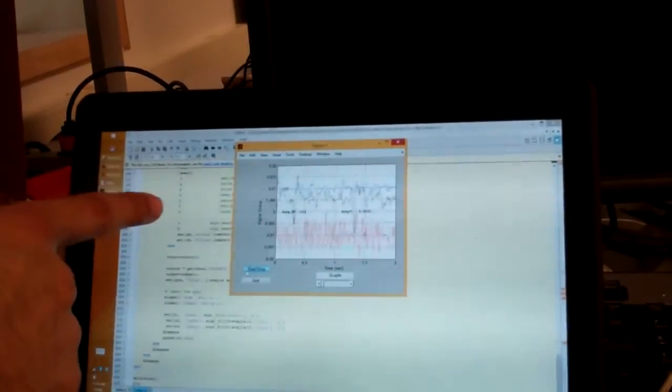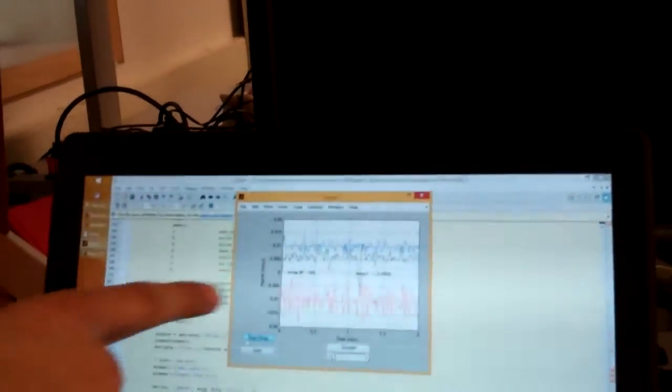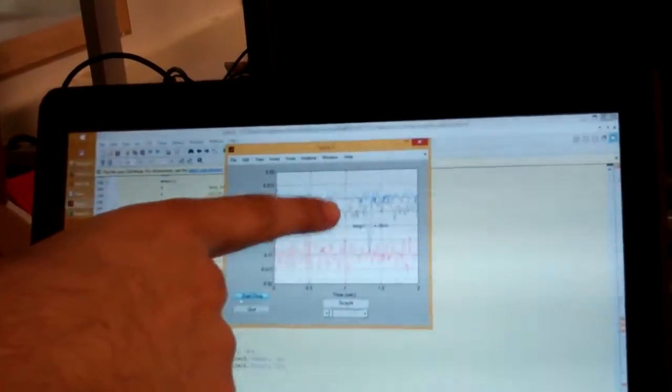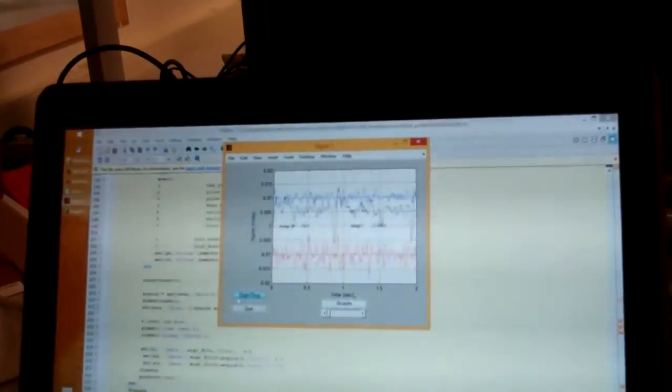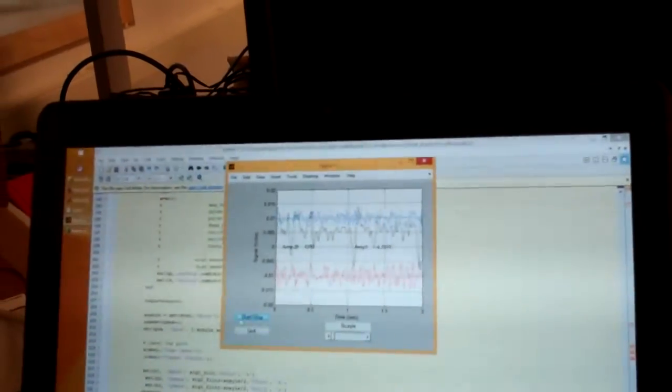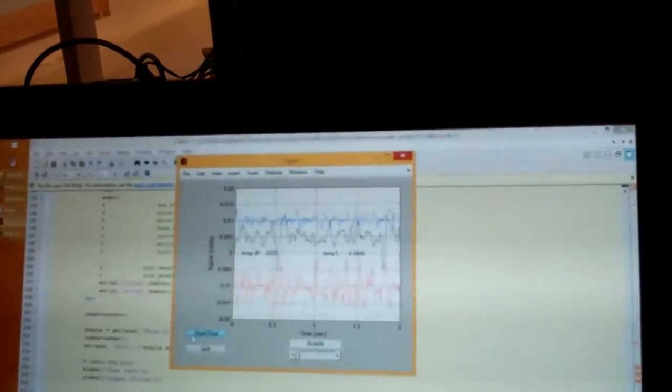So the black signal is the one located right above the eye. You can see the motion artifact for the blinking right there. Oh yeah, very large motion artifact for the blink. The blue one is located right above that over there and then the red one is at the back for the occipital lobe where the alpha waves originate. And I'm seeing some rhythmic activity on the back electrode there.